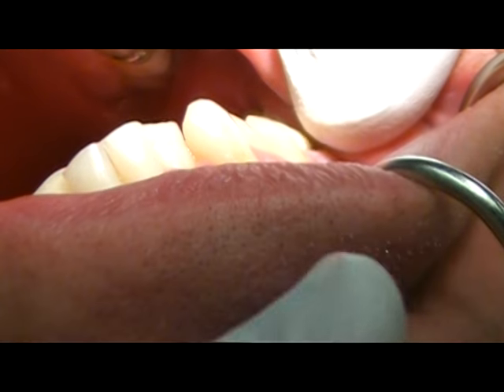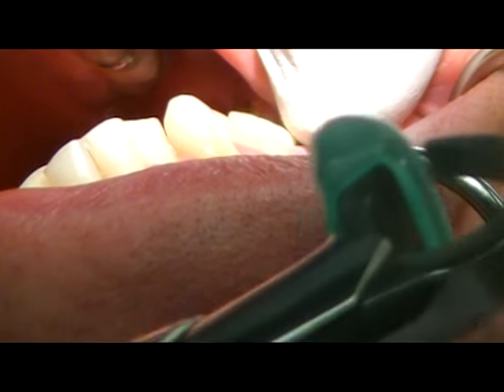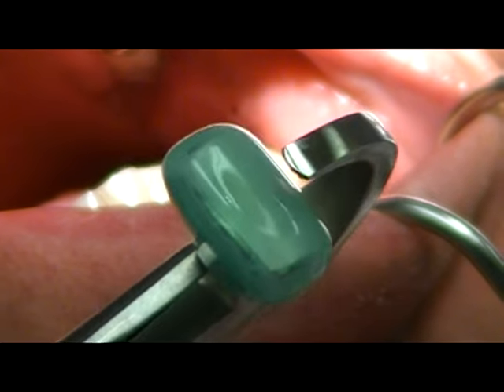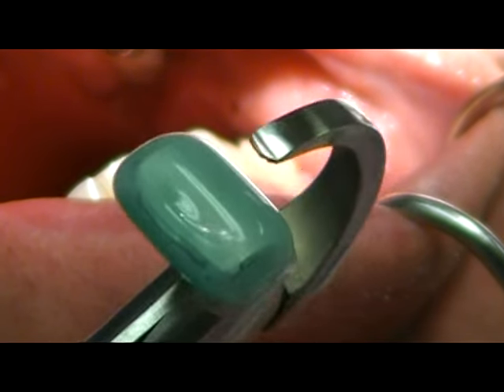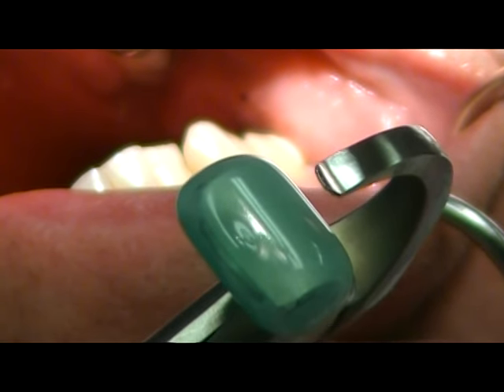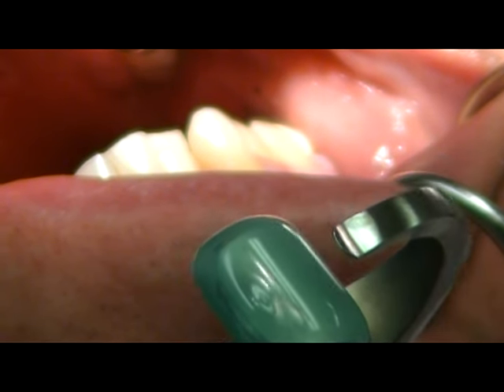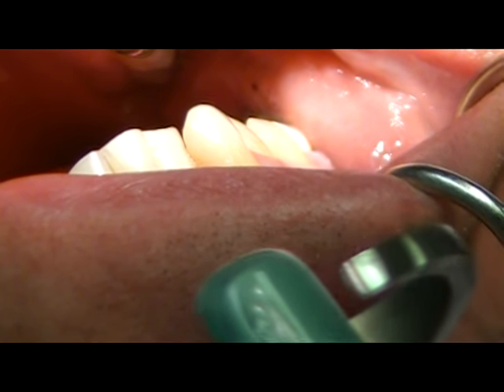The physics forcep has a flat end green bumper area and then a beak area. The bumper will be positioned onto the facial surface in the vestibule as far apically as possible, and the beak will engage the lingual surface of the tooth.